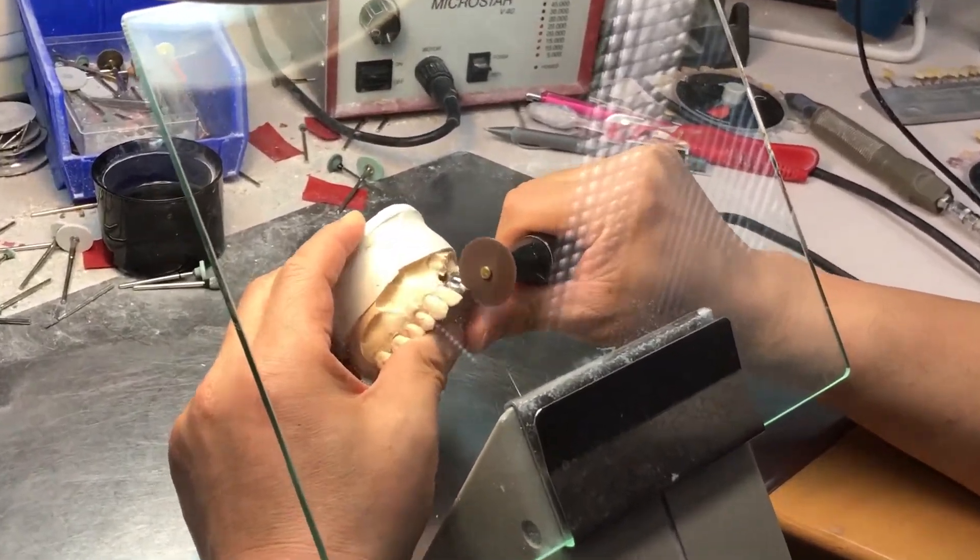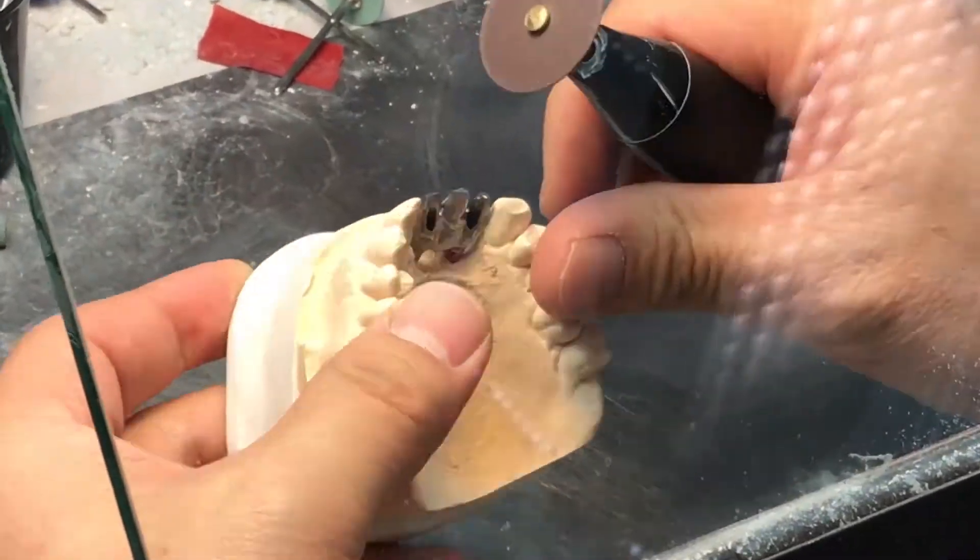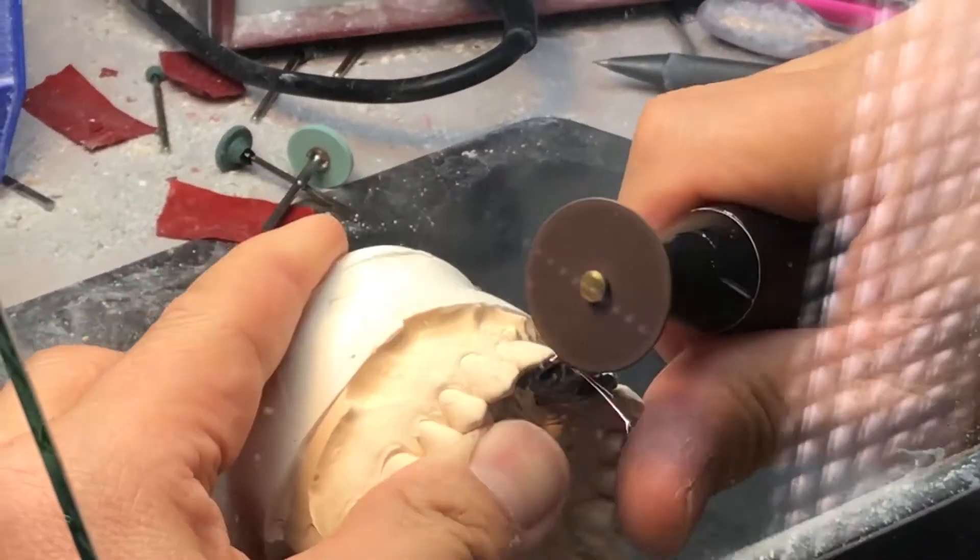After the titanium bridge has been milled, we grind it to the right shape to act as the framework for the bridge.